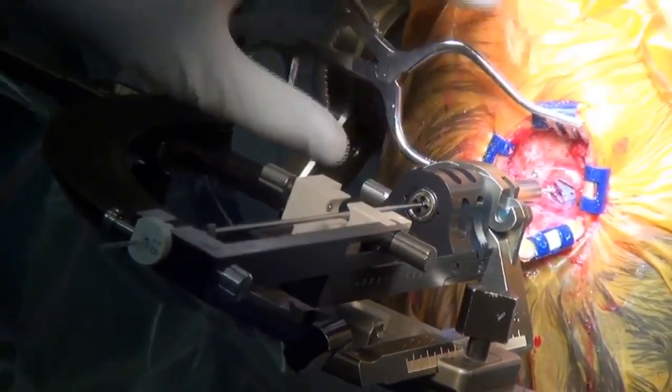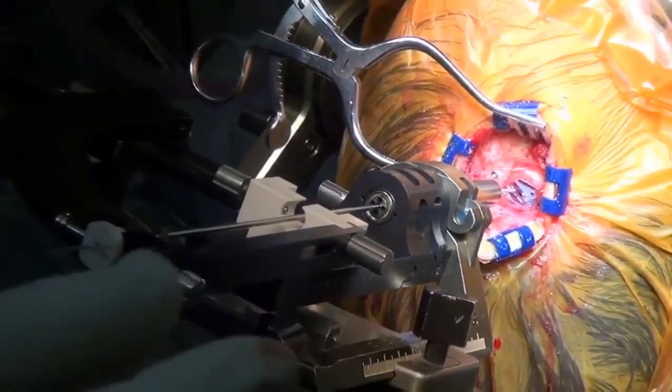Okay, we just tested our stimulation, looking to see if we have any motor side effects at higher voltages, and that looked good. Okay, there you go. All right, can we call for CT? Okay, bayonet.